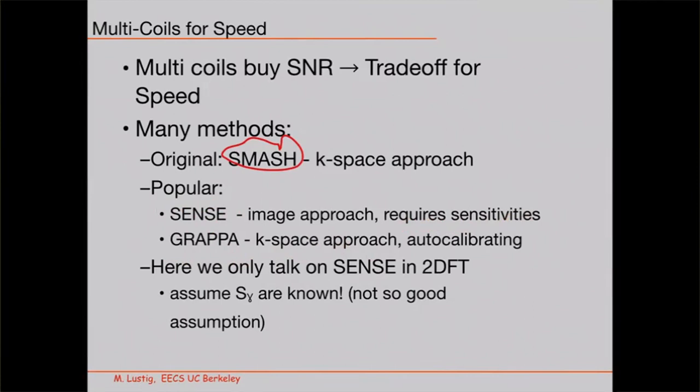Okay, so we're going to talk about SENSE, and only in 2DFT. We're not going to talk about non-Cartesian or complicated trajectories, just 2DFT. We're going to assume that the sensitivities are known, which in some cases is a good assumption, but in general, it's not a great assumption.